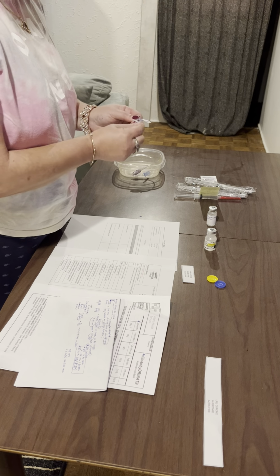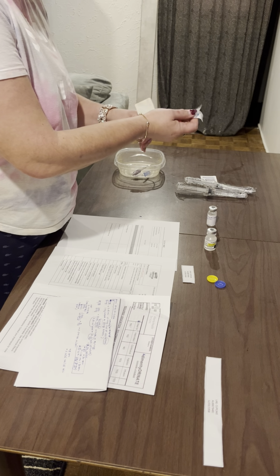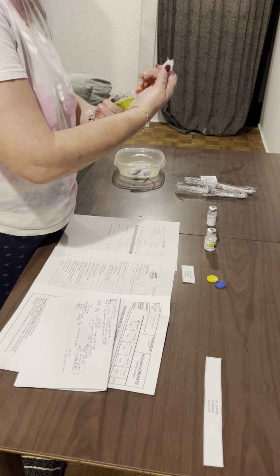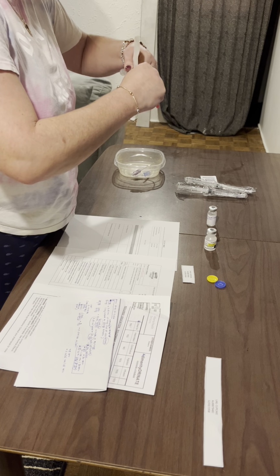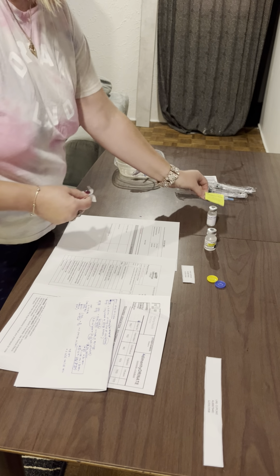Okay, again, maintaining sterility. So we'll just take the needle off here. Okay, blunt filled needle, and we'll just put the cap on, twist it. Okay, great. Cap is on. You can get rid of this in the sharps and this in the garbage. Great. So the next thing that we're going to do is we are going to get our flushes ready.